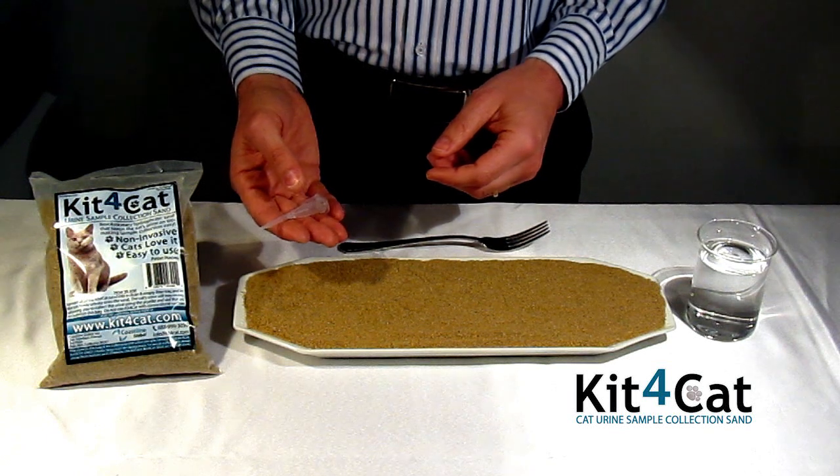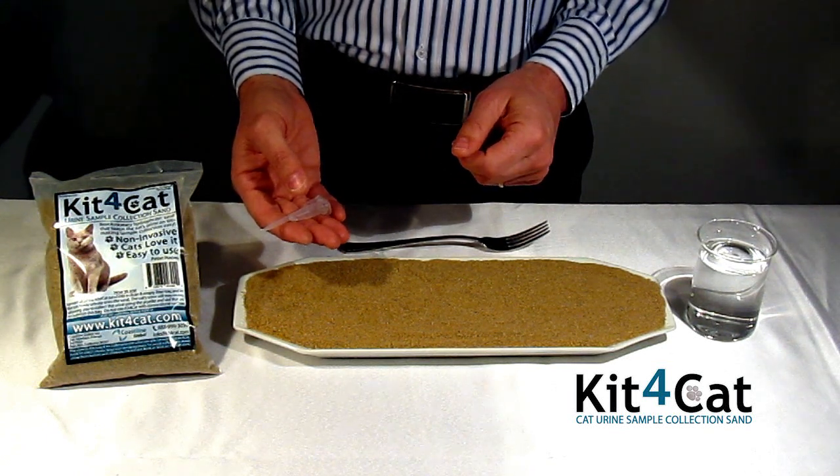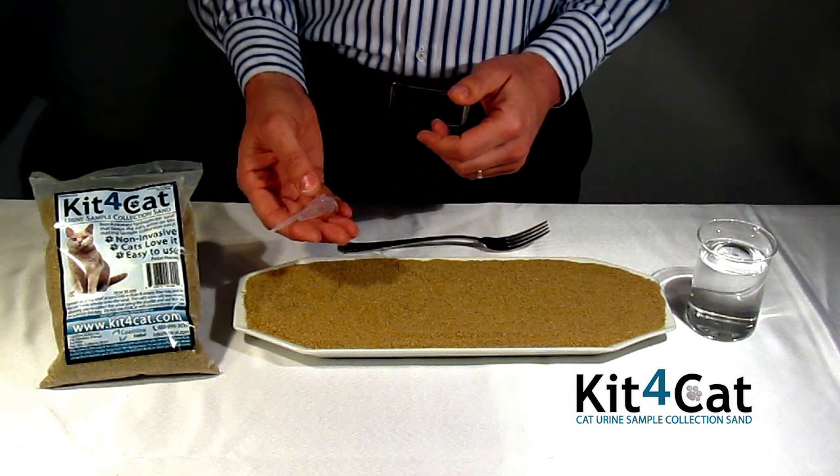We would like to introduce to you Kit4Cat, a new revolutionary non-invasive method for collecting cat urine samples. It is made of natural sand which has special hydrophobic properties.